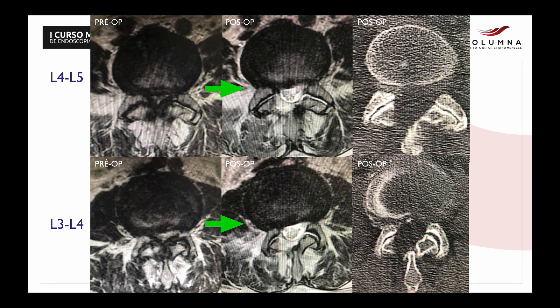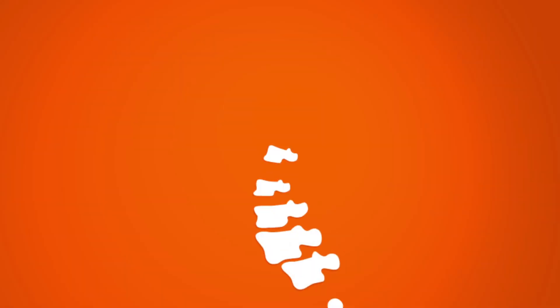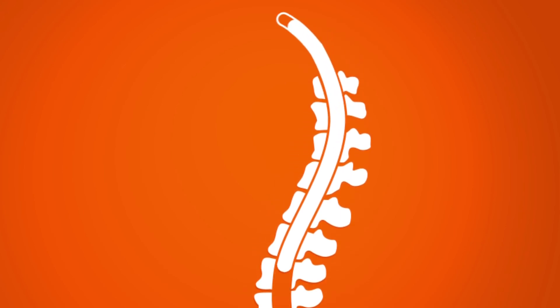Now, in the upper part of the image L4-L5, and the lower part L3-L4 — we see a very important difference. The canal is really reconstructed with no obstruction left. We can see the dural sac free with no compression remaining. This is the post-op image — the sagittal post-op image and the axial images — showing a very good decompression. Thank you for your attention. If you have any questions, write them down here or send me an email. See you!